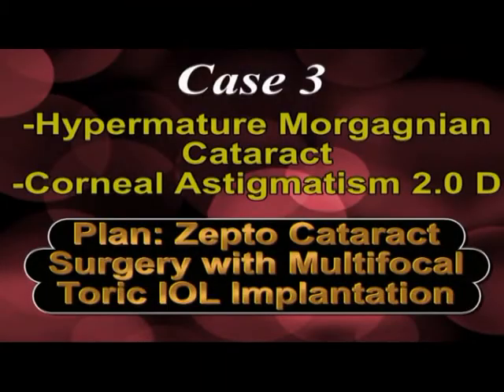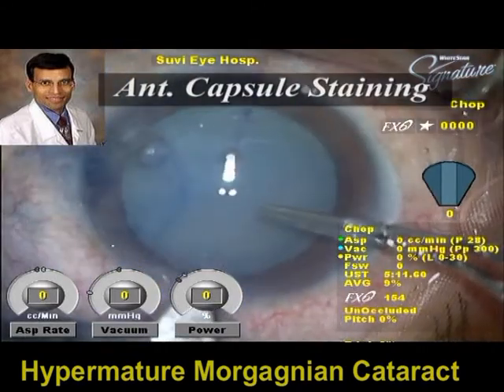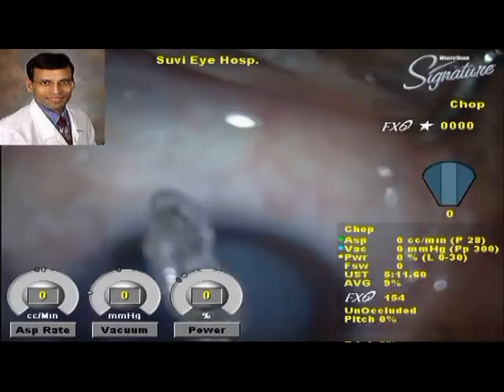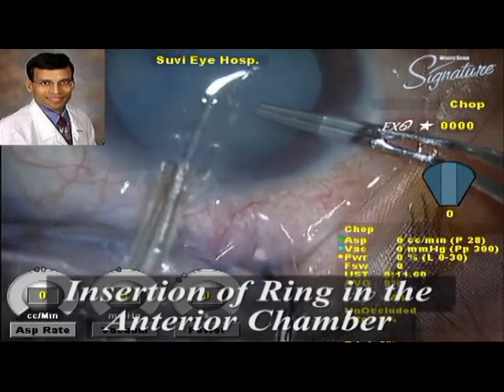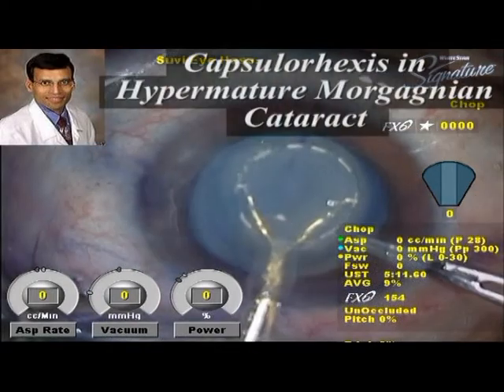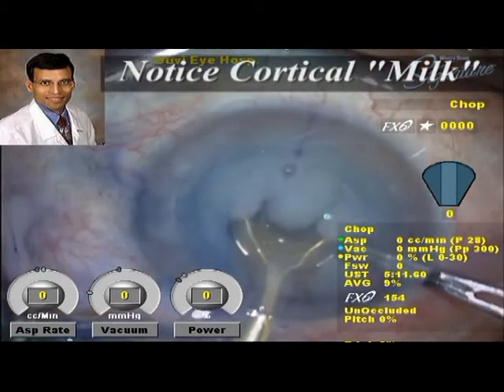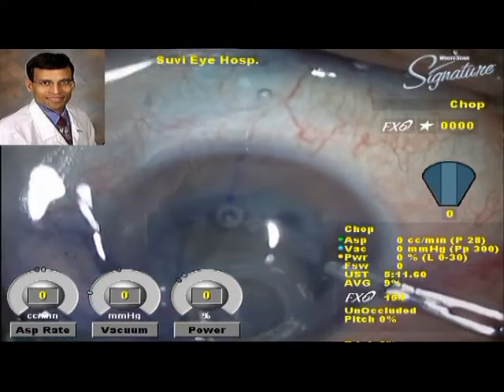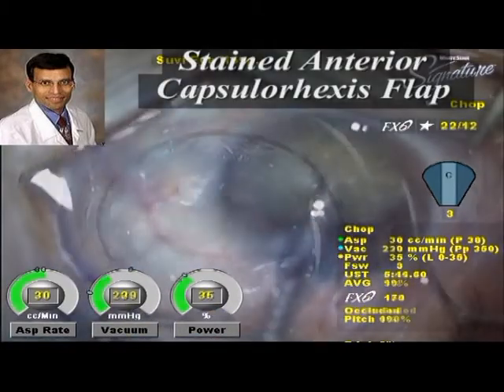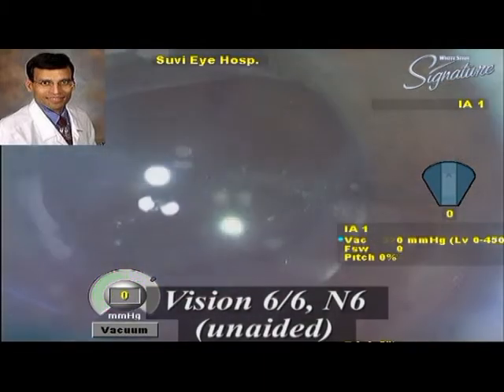The third case is a hyper-mature Morgagnian cataract with two diopters of astigmatism, with a plan to implant a toric multifocal IOL. After marking and staining, the Zepto handpiece is prepared and inserted into the anterior chamber. Under direct microscope visualization, the capsulotomy device is centered and the nanopulse technology applied. A large amount of milky fluid escapes as expected in a Morgagnian cataract — a manual capsulorexis would have been extremely difficult here. Because a 360-degree simultaneous capsulotomy is created, the fluid escapes all at once and there is no risk of an Argentinian flag sign.